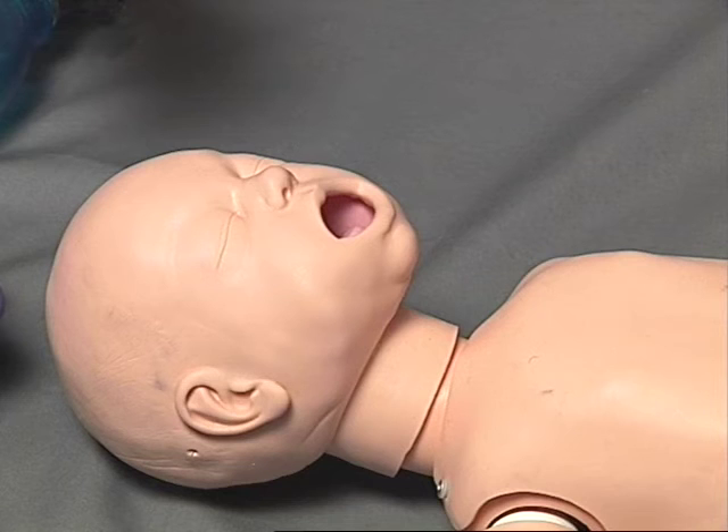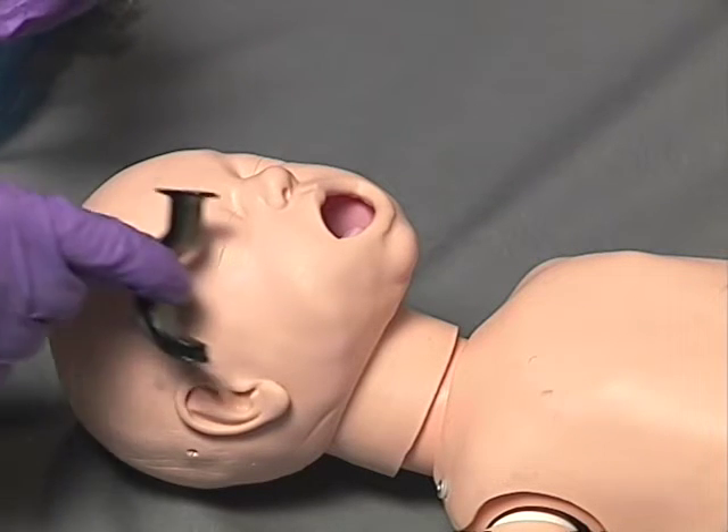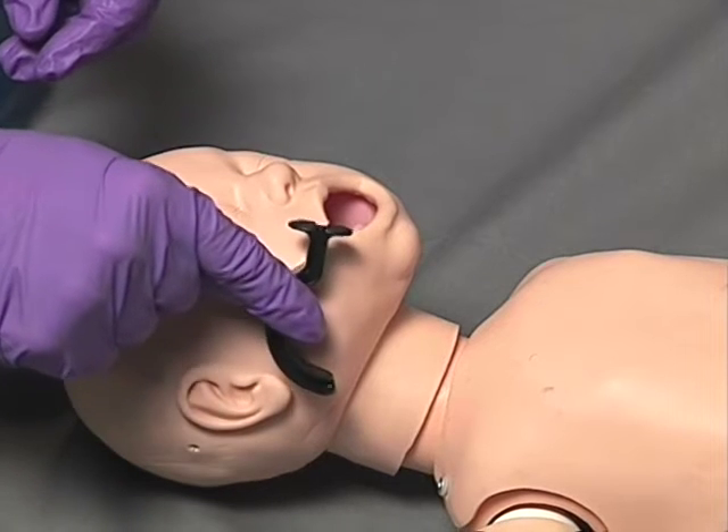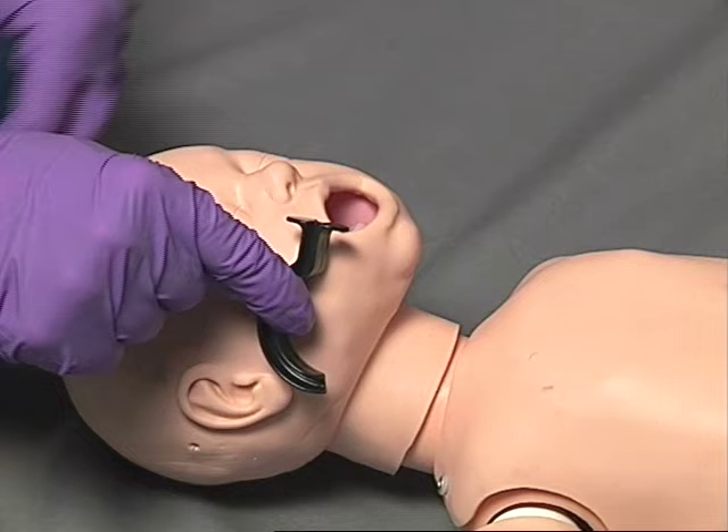Similar to adult oral airways, pediatric oral airways are available in a variety of sizes. Select the appropriate size by measuring the oral airway against the side of the patient's head. The oral airway should extend from the corner of the patient's lips to the bottom of the earlobe or the angle of the jaw.